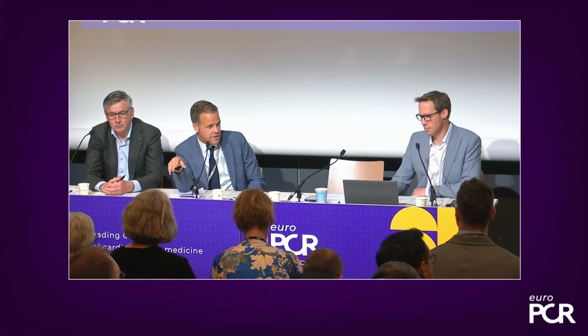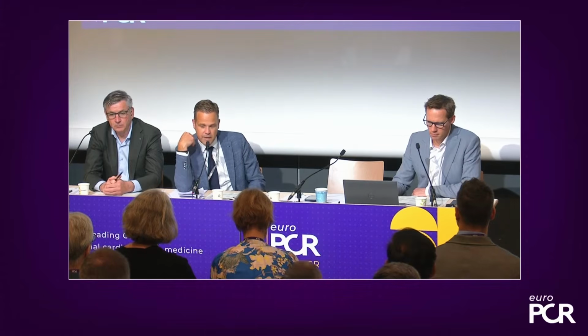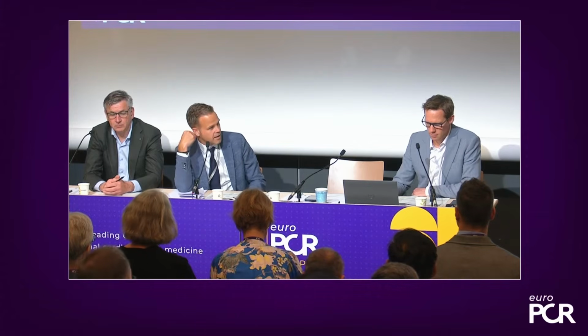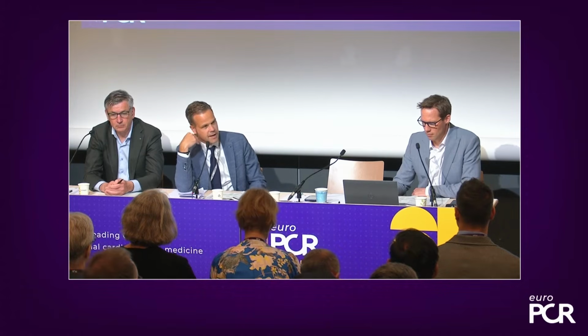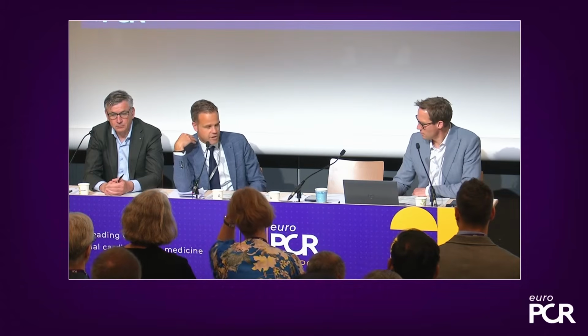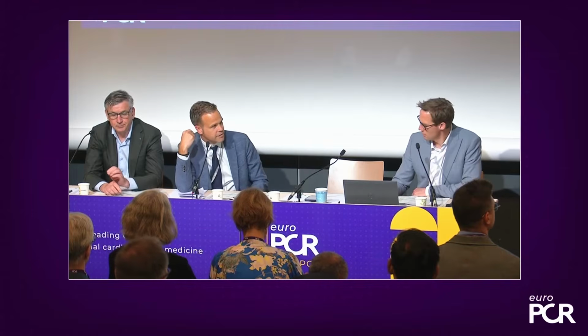Because the patients are in atrial fibrillation, flow velocities in the left atrial appendage are quite low. So having defects, or the LAA not completely filling in the early phase, is something you quite frequently see. If you do a delayed phase acquisition as well, that's helpful, because then there's a higher chance of complete filling of the LAA. And if you don't do that, there will always be a discussion if there is a thrombus, yes or no.